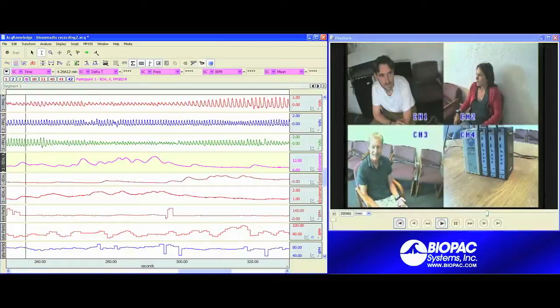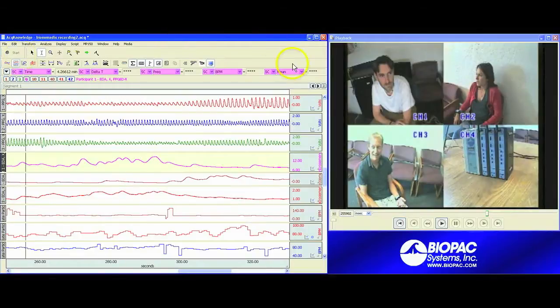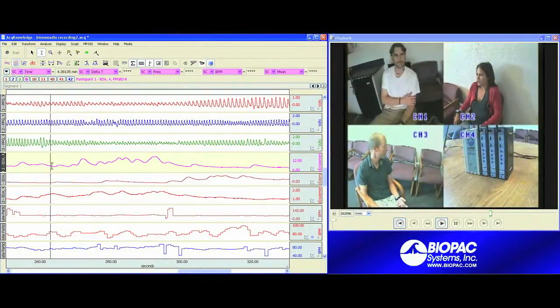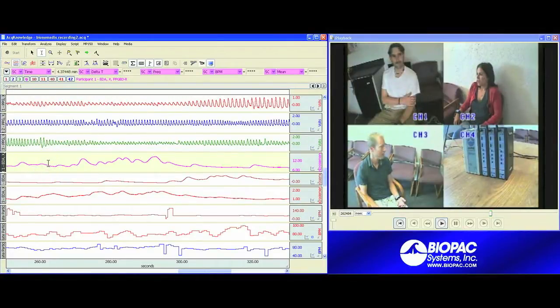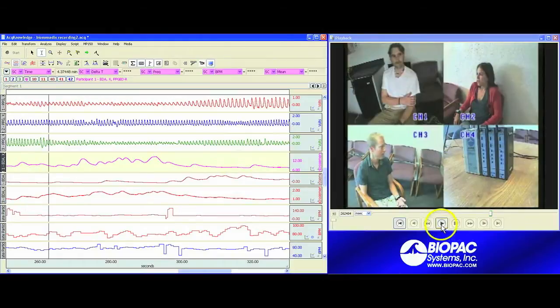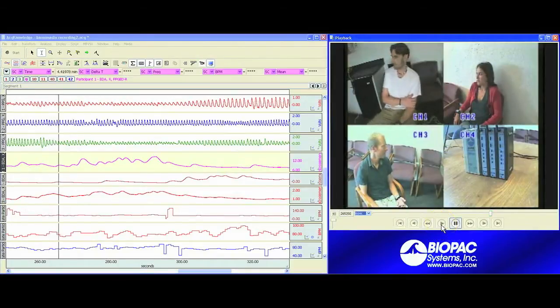Another way we can take a look at the link between the video and the physiology is to take a look at our physiology data on the left-hand side and select an area that we're interested in. We can do this either frame by frame by simply clicking on data points, or what we can do is go to the beginning of this area and then click on play to watch what's transpiring in our conversation.